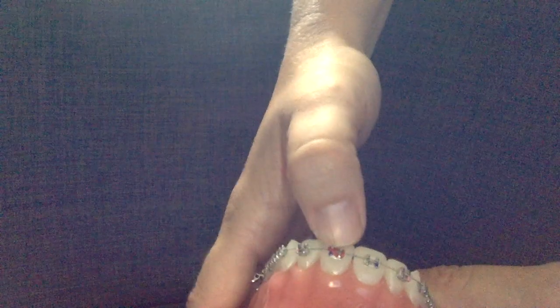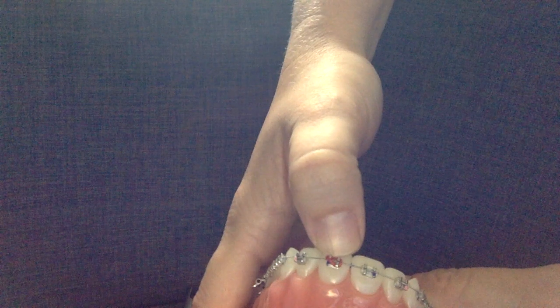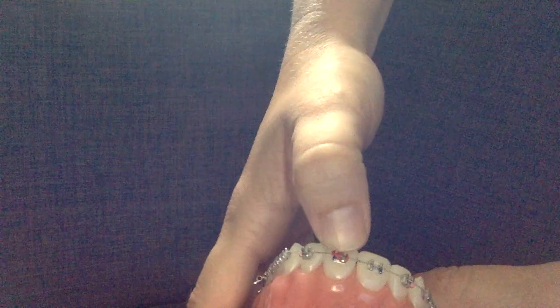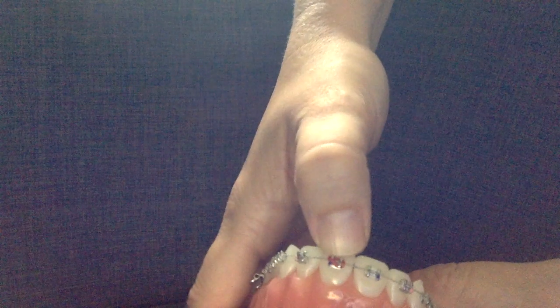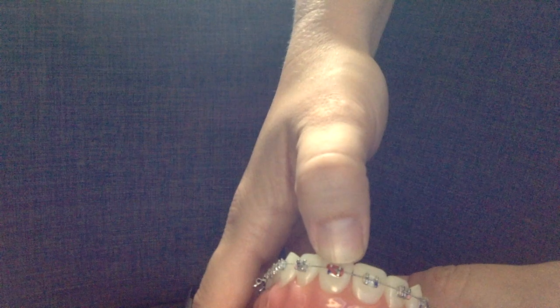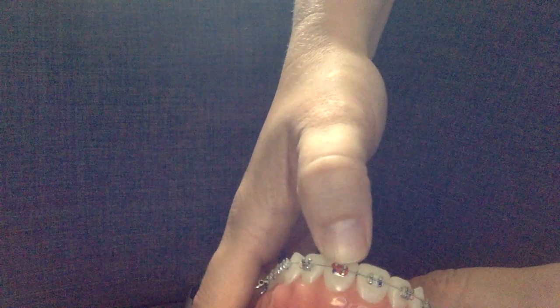Usually if it slips off, or if the assistant doesn't do it fully and you catch it, you can always call and have it corrected. It's also something you may be able to easily do at home. I recommend taking some very fine point tweezers, gently pinching the ligature, lifting it up and over. It's the easiest way to do that.